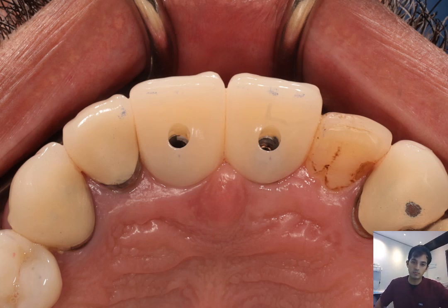These are screw-retained restorations. I try and keep all my provisionals, in particular, screw-retained, because if I want to modify that provisional to play around with the emergence profile to optimize it for that particular case, it's just a lot easier getting a screw-retained case in and out, and ensuring that it's seated all the way. If you're trying to bulk out a part of that provisional, sometimes getting a cement-retained one to seat with all that tissue pressure can be difficult, so having a screw-retained provisional really helps for that.